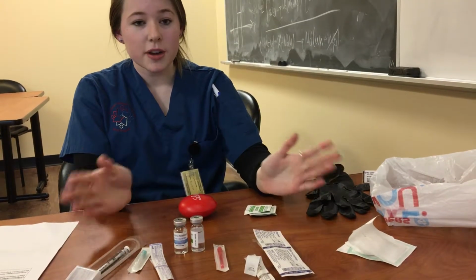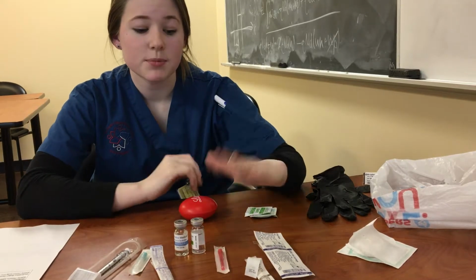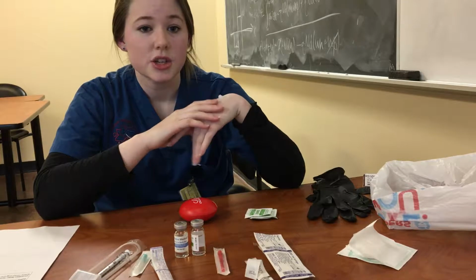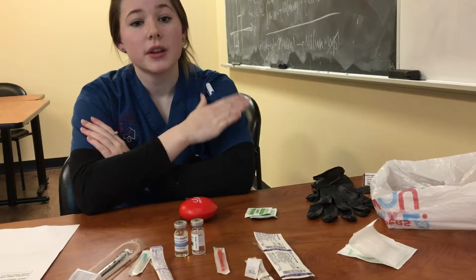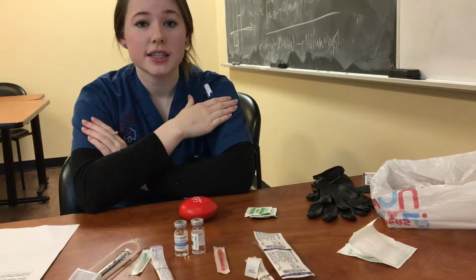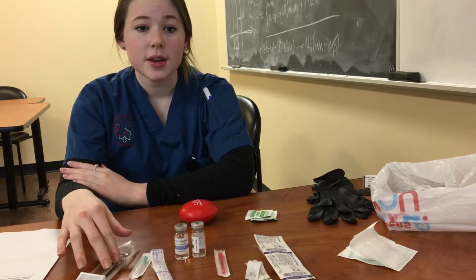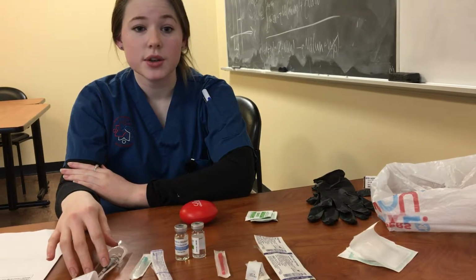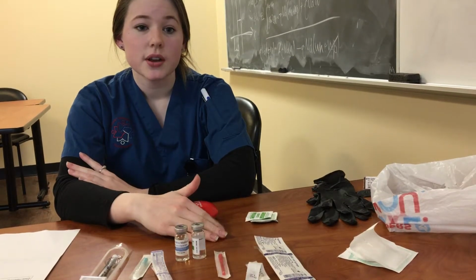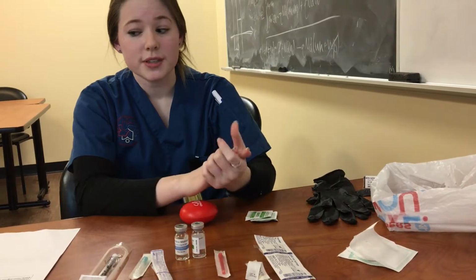Finally, I want to let you know a little bit about the equipment that I have in front of me. Subcutaneous injections are performed using the smaller of the 2 needles, and that's just based on the volume to inject and the type of medication. And because we are going only into fat, compared to IM, we're going to want a longer and a wider needle because we're going directly into the muscle tissue. For subcutaneous, we're going to be using a 1 to 3 milliliter syringe with a gauge of 22 to 27, and then intramuscular 2 to 3 milliliter syringe with a 21 to 23 gauge, both of which are quite small. We want to be very precise in what we're doing.